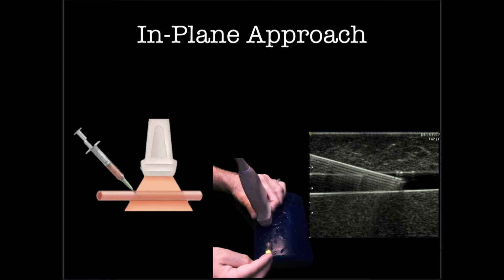So this is that ultrasound phantom that I loaned your residency. It's just a blue block that you can image. And it looks kind of gray, like soft tissue. And it has tubes in it. Now the tubes are not arteries or veins, they're just tubes. So they'll compress when you push on them. Now when you stick your needle under there, you can see the needle.